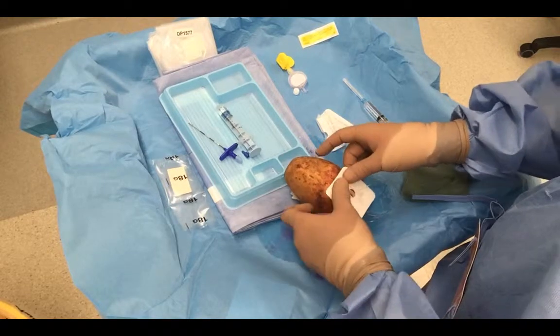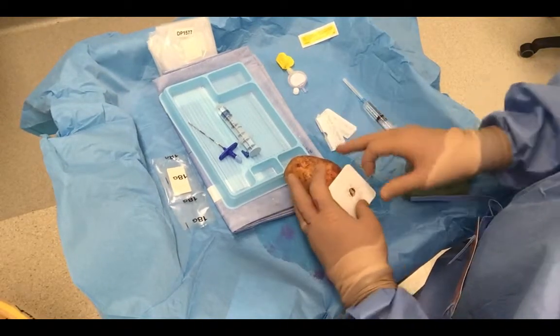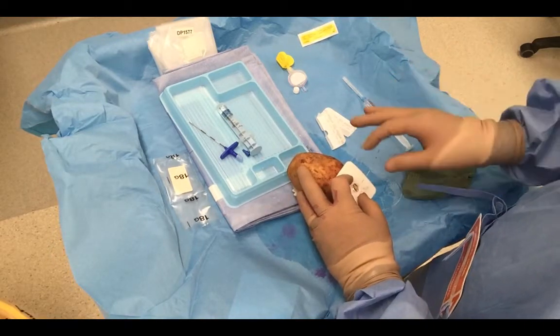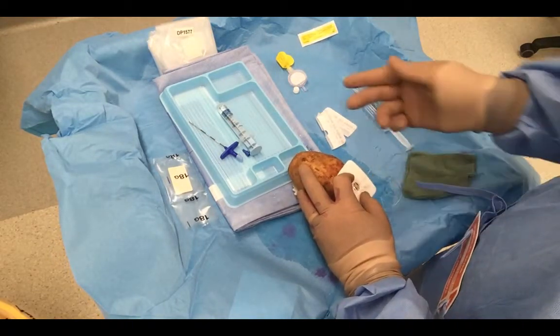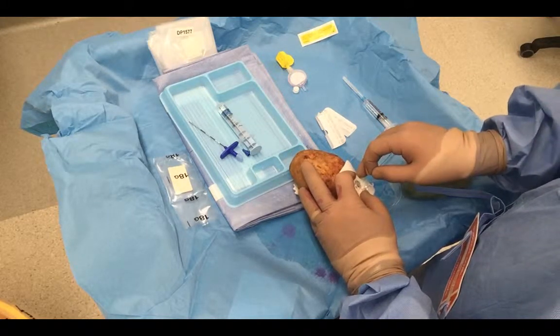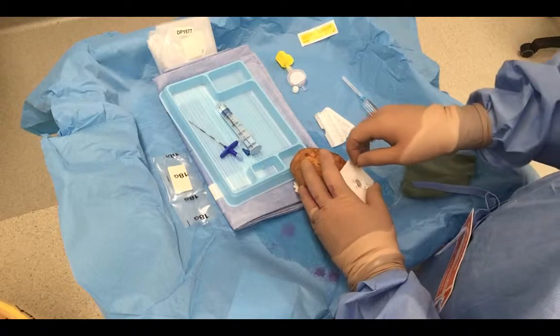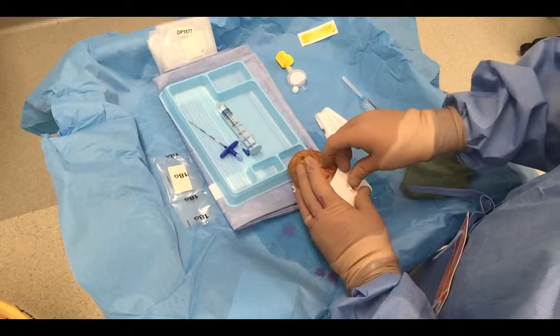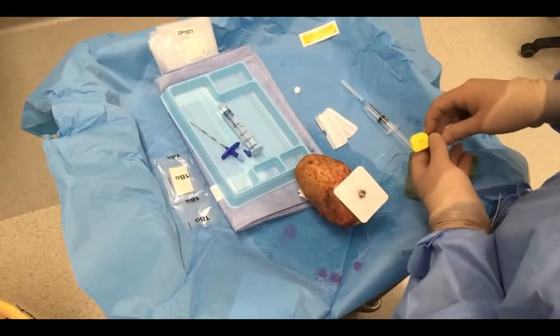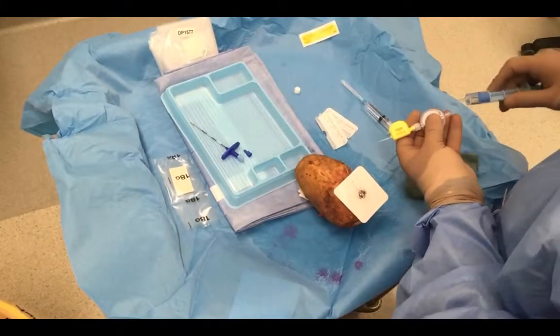Catheter lock's in place. Okay, I'm going to withdraw my catheter now. Commonly we'd like 4 centimetres plus the distance to the epidural space. So 3 centimetres to the epidural space plus 4 is 7 centimetres. 9, 8, 7. Catheter should be in the right location. I'm going to lock my catheter. Now I'm going to connect it. Catheter's now in position. We'll attach our hub.